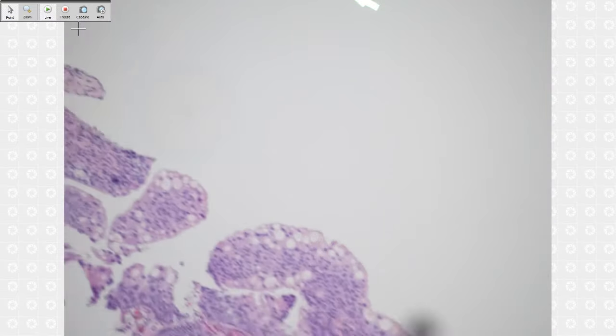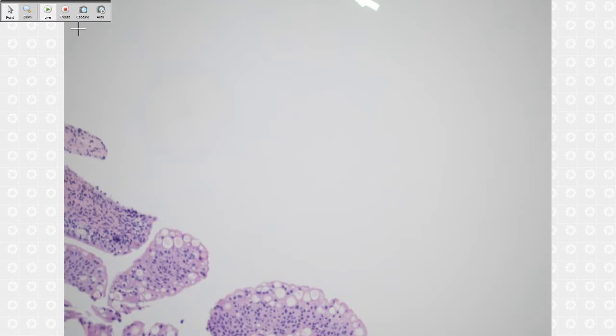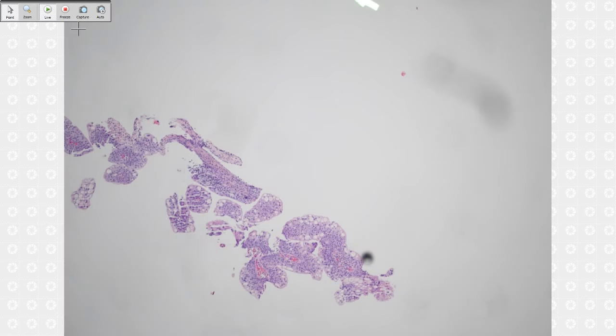If you go to a textbook, you will see this kind of lesion with cytoplasmic vacuoles and umbrella cells. Just ignore that. So this is the urothelial papilloma. Okay, remember this one, classic urothelial papilloma.